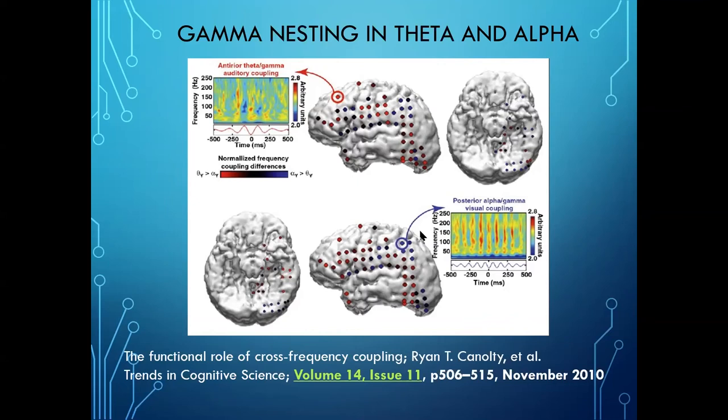In the perceptual area, beta and gamma are nested within alpha. There's an alpha wave, and you can see the nesting of the faster frequencies within the negative half wave of the alpha. So the infra-low frequency is, again, a modulation. It's the on and off of activity in general. The whole EEG is nested in the phase of the infra-low frequency, but the theta and alpha are carrier waves that end up having the faster frequencies present in them. Now, cross-frequency coupling, when it's real, the gamma and beta occur in brief bursts called chirps, and these are called nests. Sounds like a bunch of bird brains, doesn't it? The nests are full of chirps.